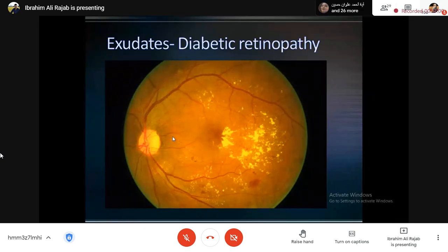Amin, you should describe this image totally. You are experienced now. Okay doctor, the optic disc cup is not very clear. Right, well done, it is not very clear because the image capture was taken with very high light, so it is not very clear. Okay, skip it. And the macula is dark. Yes, you skipped the blood vessels. Okay.